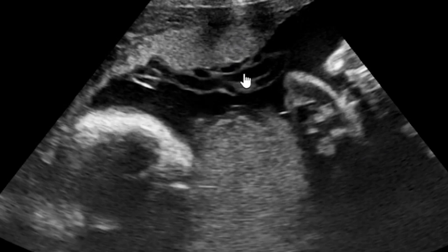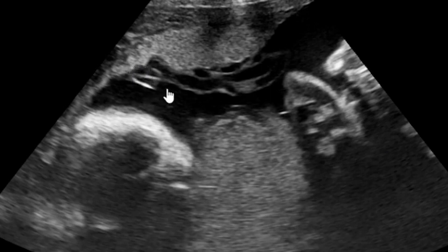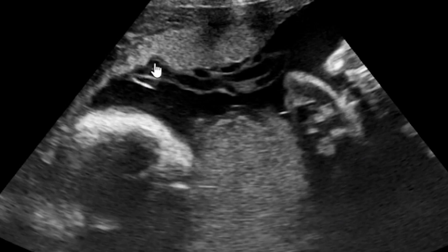What you are seeing here is the umbilical cord. You can see that instead of it coming to attach on the placenta, it is actually attached on the wall of the uterus at the endometrium. This attachment is what we refer to as a velamentous cord insertion.